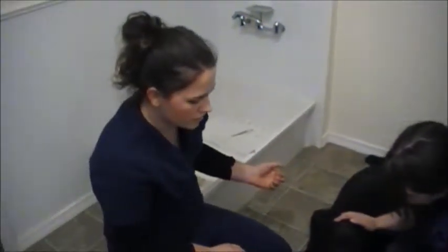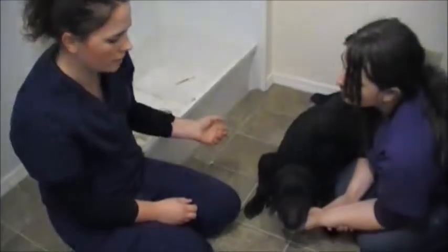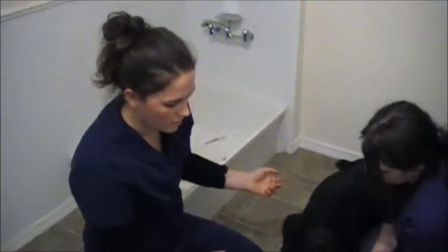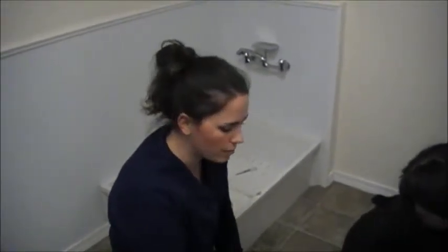You can know that the tube is placed correctly in the stomach by making sure she's not coughing. In an awake patient, they will not easily let you put it into the trachea rather than the stomach. They would resist against that, so you would have a hard time doing that. She would cough if it was into the trachea, and then into the stomach you'll be able to see it going down the throat also when she swallows. And that is a simulation placing a stomach tube in a dog.